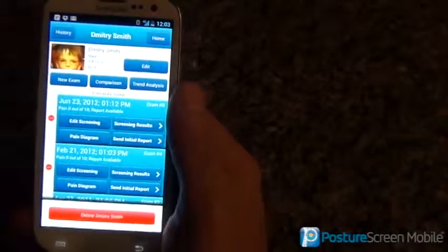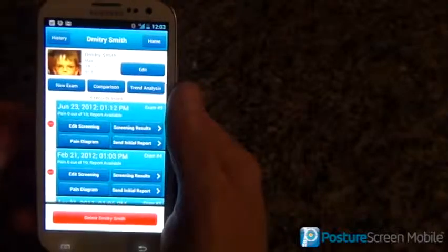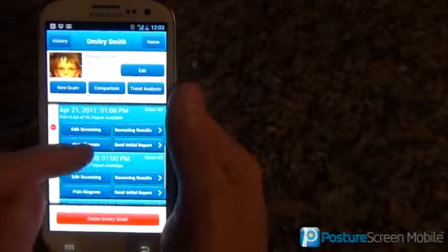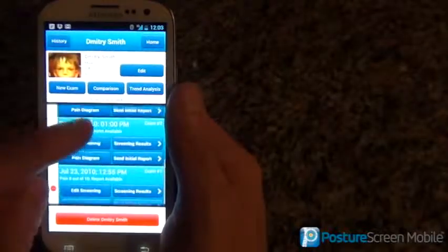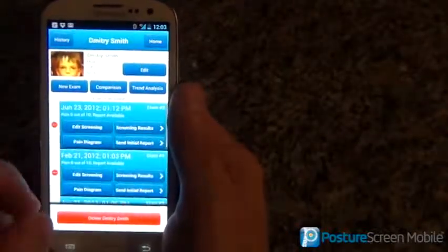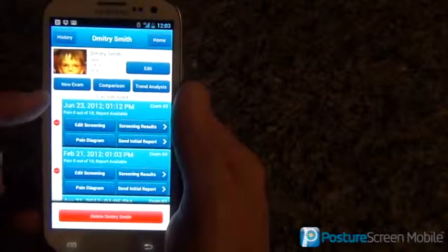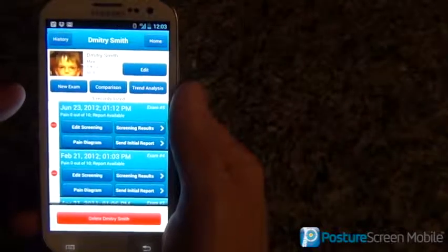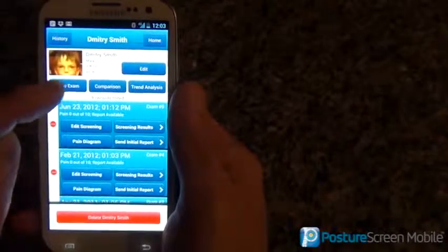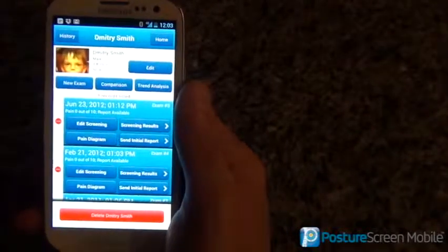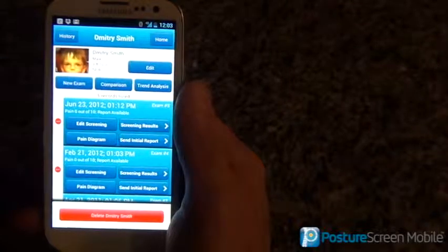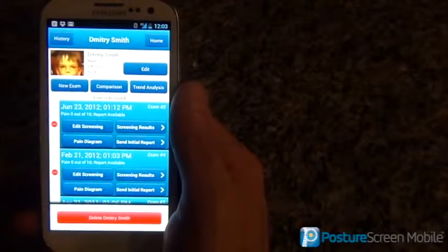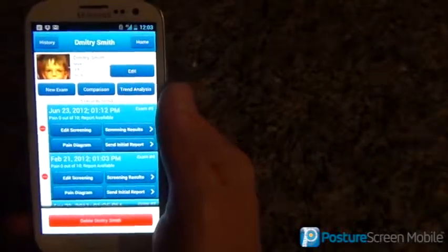When you have existing patients in there, you can see we have different exams. When you have existing patients, all we have to do — if I wanted to do another one on Dimitri — is just hit New Exam. You wouldn't create a new account for Dimitri because they're already in our account.